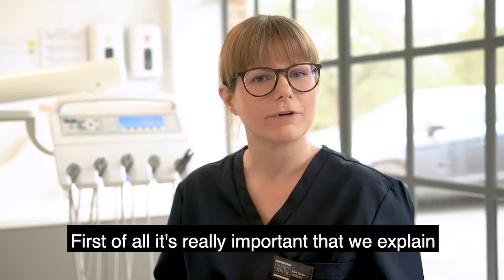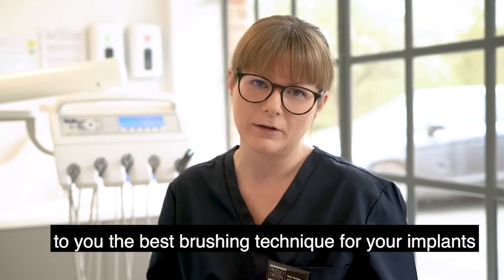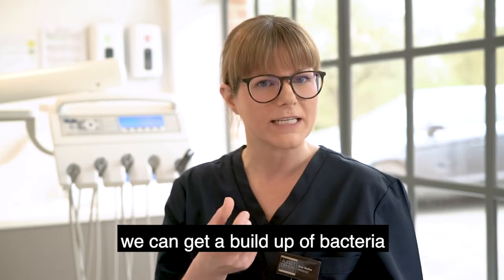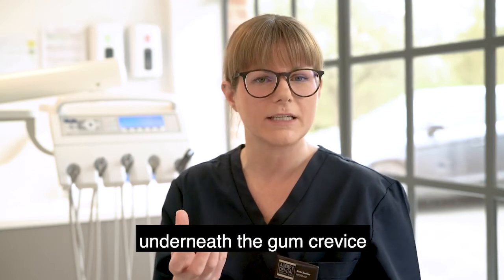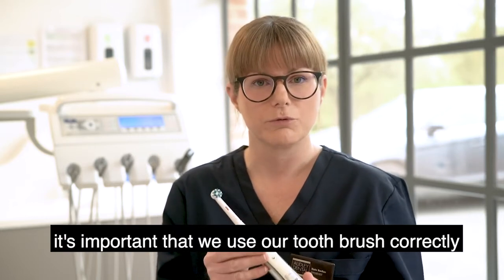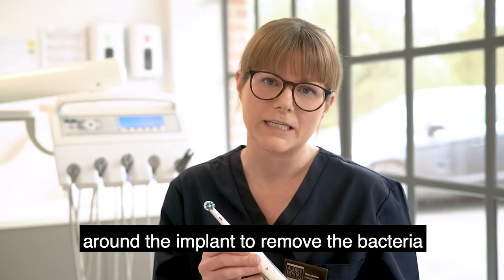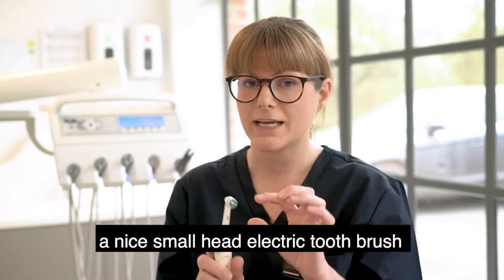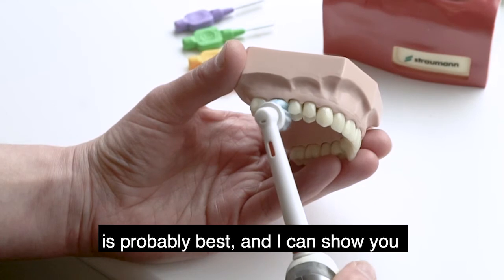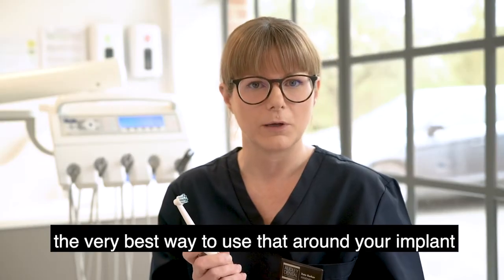First of all, it's really important that we explain to you the best brushing technique for your implant. We can get a build-up of bacteria underneath the gum crevice, same as we can around our own teeth. It's important that we use our toothbrush correctly so we get into the gaps and crevices around the implant to remove the bacteria. A nice small head electric toothbrush is probably best, and I can show you the very best way to use that around your own implant.